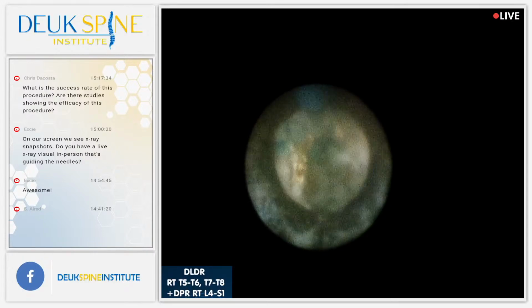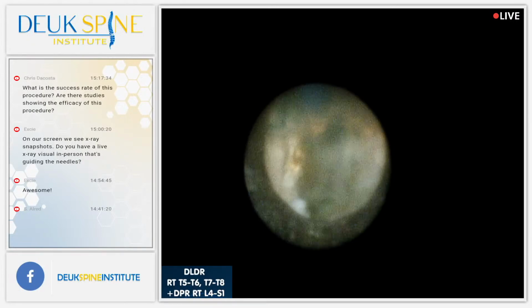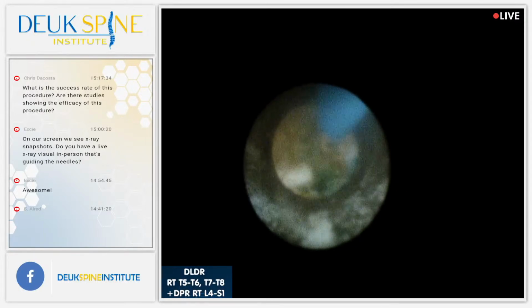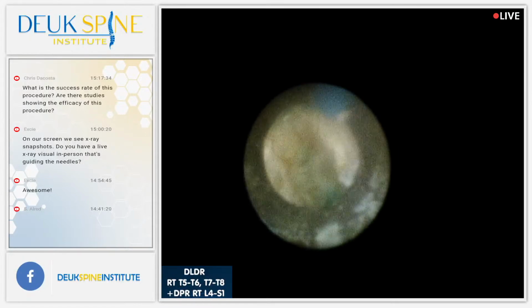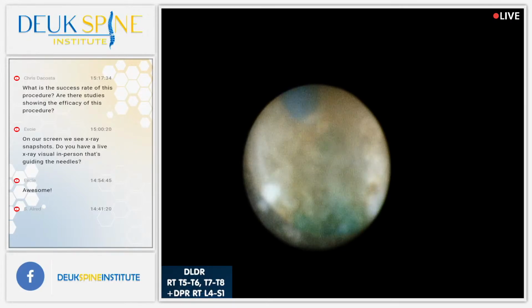All right, so the laser fiber is 0.5 millimeters, half a millimeter, and the inside of this tube, remember the outside diameter is 4 millimeters, the inside diameter is around 2.5 millimeters. So the inside of that tube you're looking at is only 2.5 millimeters. That's such a small space. If you take your fingers and spread them apart, just barely enough to let a little bit of light through, that's what we're dealing with here. So it's not a big area we're fixing.